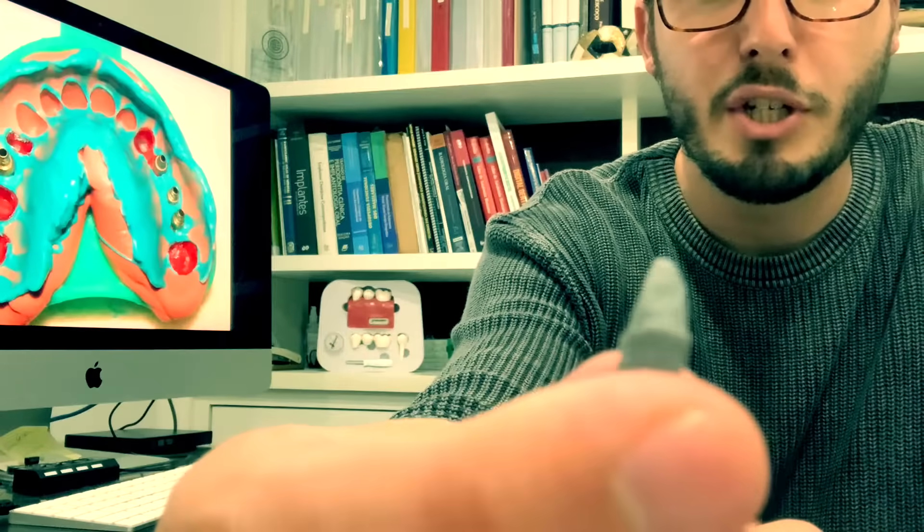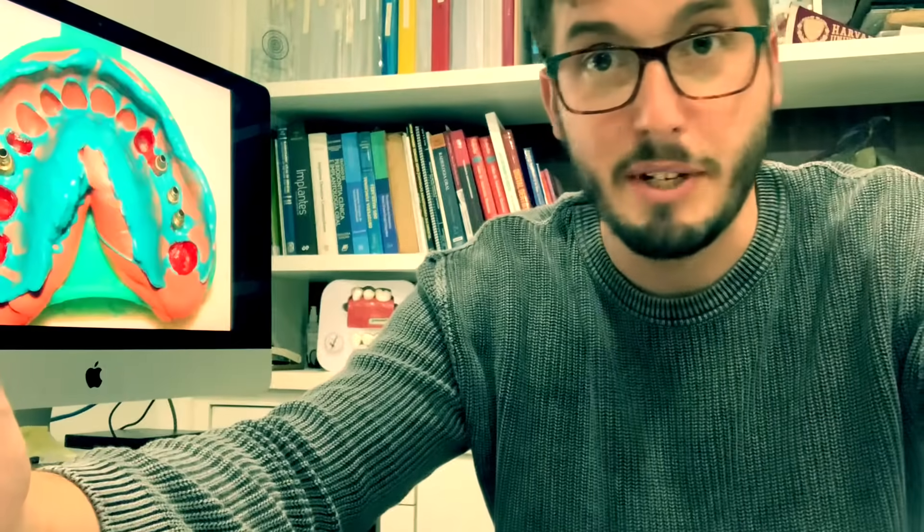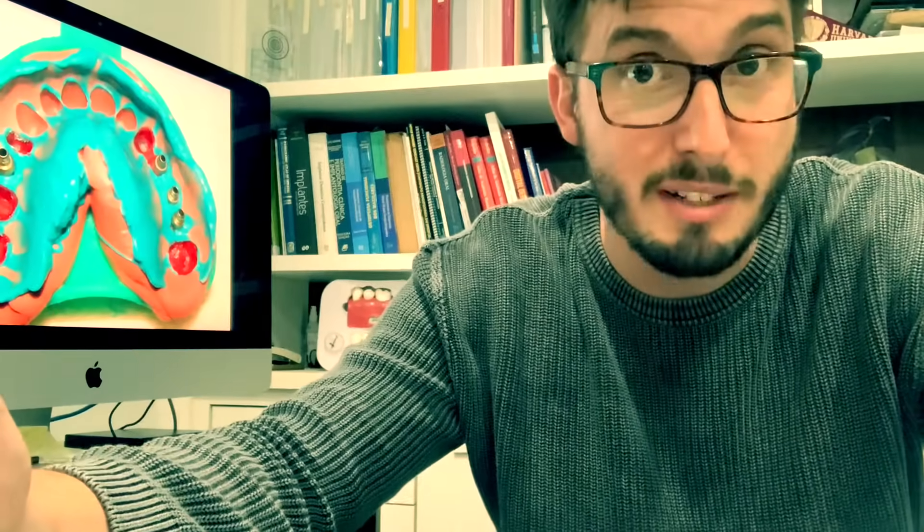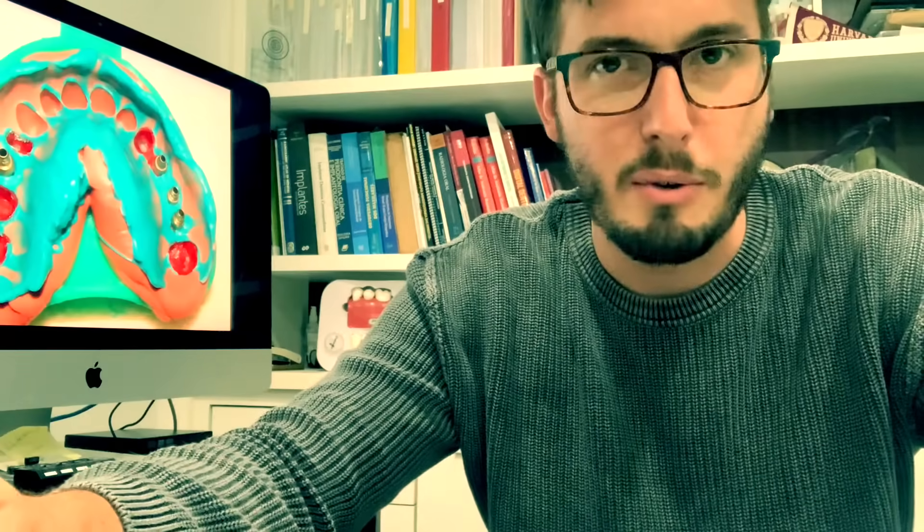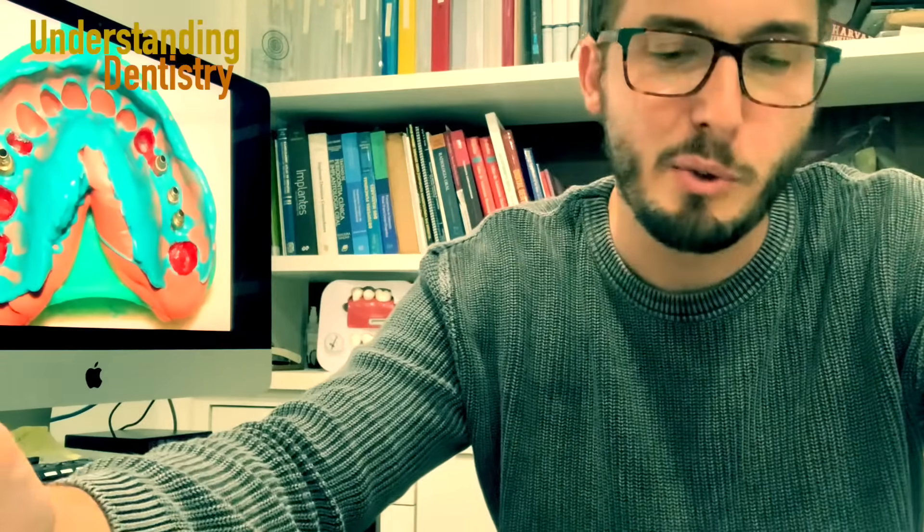Okay, so those are the two different ways. That's how you are going to receive your crown on dental casts. Either a 3D printed dental cast if you want to 3D print your dental cast, because that's not really required for digital workflow, or if you are using conventional workflow then you are going to receive usually the crowns on the conventional dental casts.